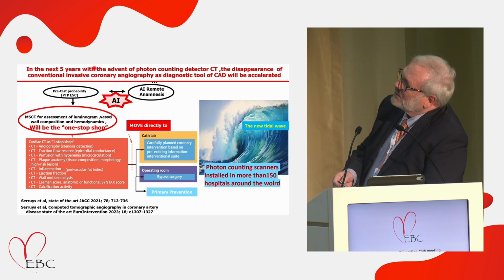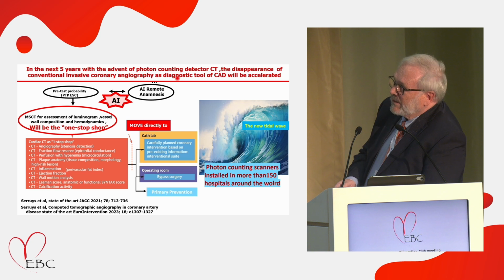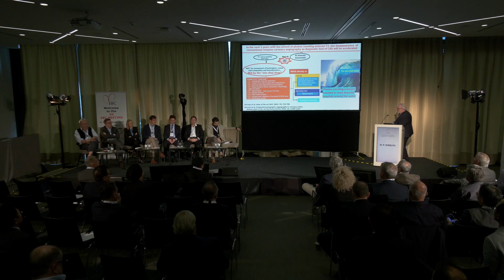In the next 5 years, with the advent of photon counting detector CT, the disappearance of conventional invasive coronary angiography as a diagnostic tool of CAD will be accelerated. And just now, there are already 150 hospitals in the world. And it is said that by the end of the year, it will be 600. So I'm pleased to hear that Frankfurt will have a photon counting. Now, 2 slides.